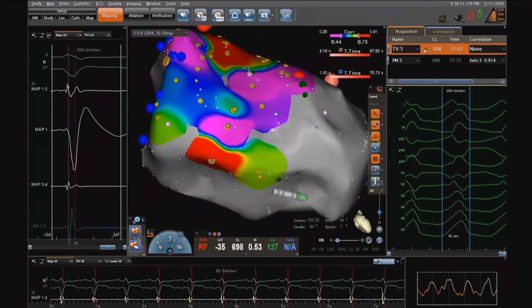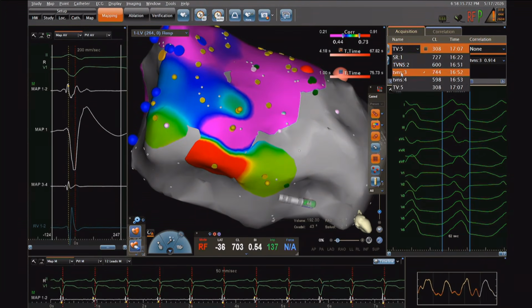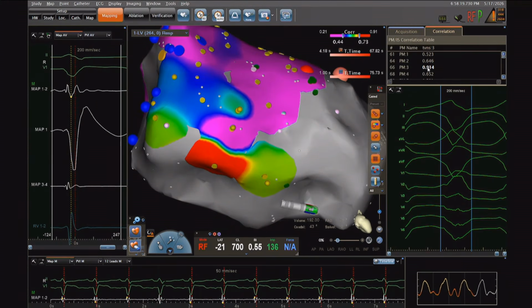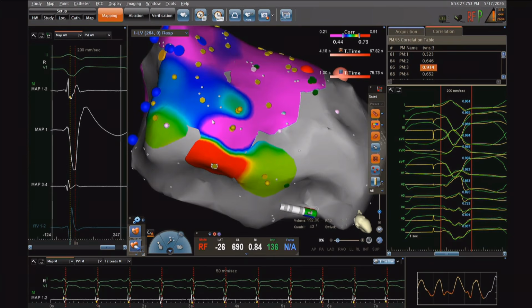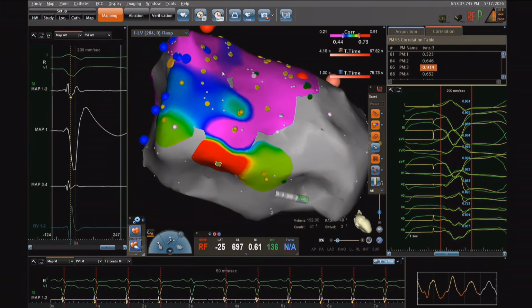So we have correlation here for this non-sustained VT, also quite high. So it will be in this septal part, I believe. So we will work on this, but that's for at least another 1 hour of work. So we will have no time to show you the result today, but we will explain it to you later.